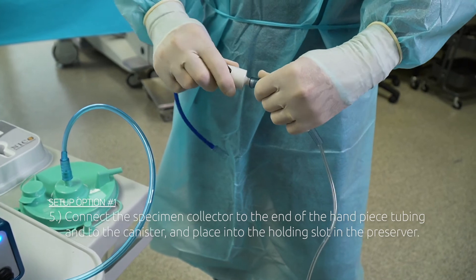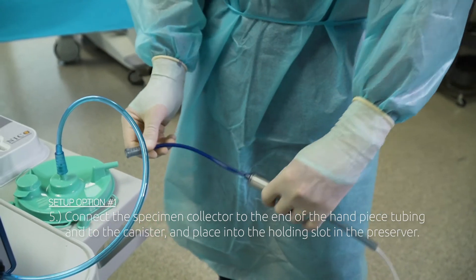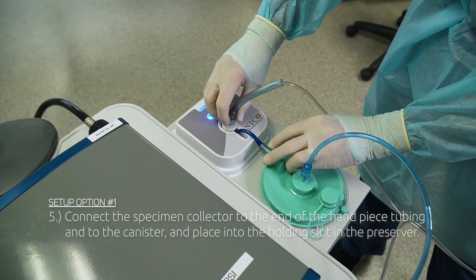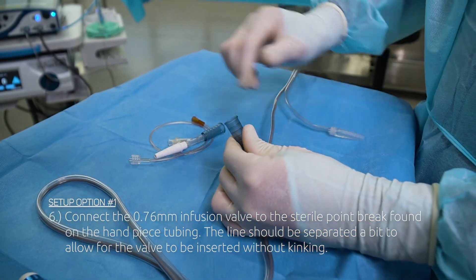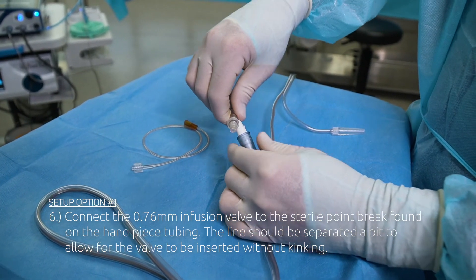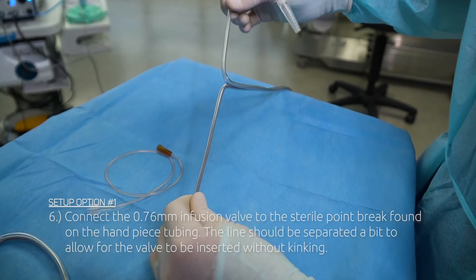Step 5: Connect the specimen collector to the end of the handpiece tubing and to the canister, and place into the holding slot in the preserver. Step 6: Connect the 0.76 mm infusion valve to the sterile point break found on the handpiece tubing. The line should be separated a bit to allow for the valve to be inserted without kinking.